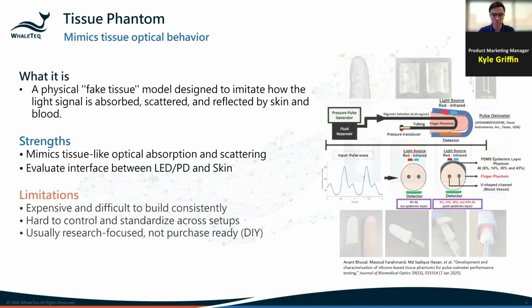The main limitations are that it's very expensive and difficult to build consistently. It's hard to control and standardize across setups, and it is usually a more research-focused method. It's not currently a commercial purchase-ready approach. So that means you generally have to build this test setup yourself in-house.